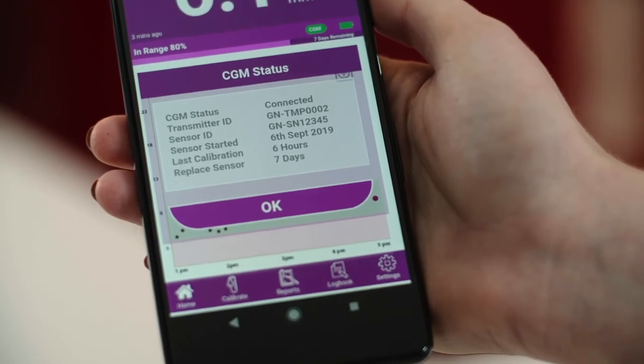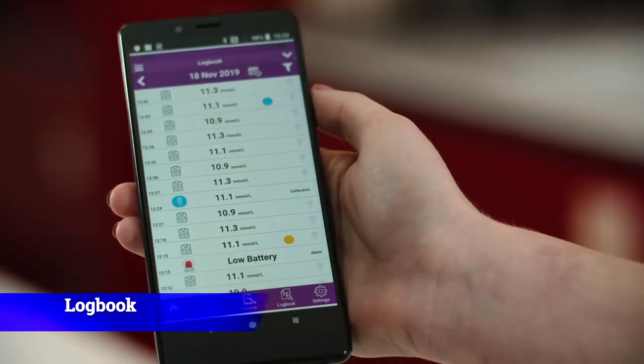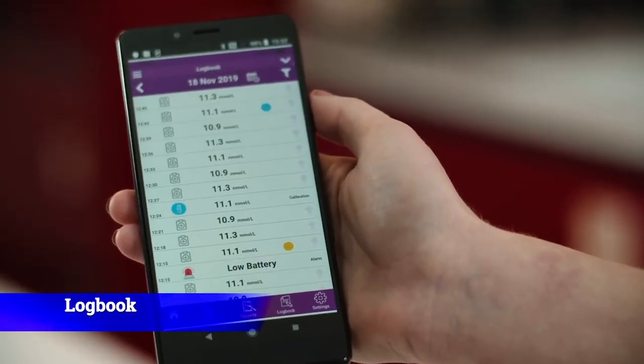By pressing the CGM button, it will give you the status of the CGM, such as when you last calibrated and when the sensor needs replacing. The event log screen records all your GluNovo app activity — this includes all your BG readings, alarms, carbs, insulin, medication, and exercise activity.